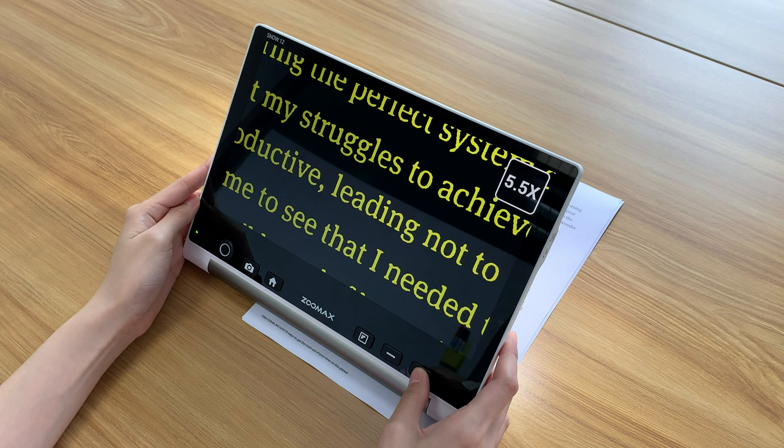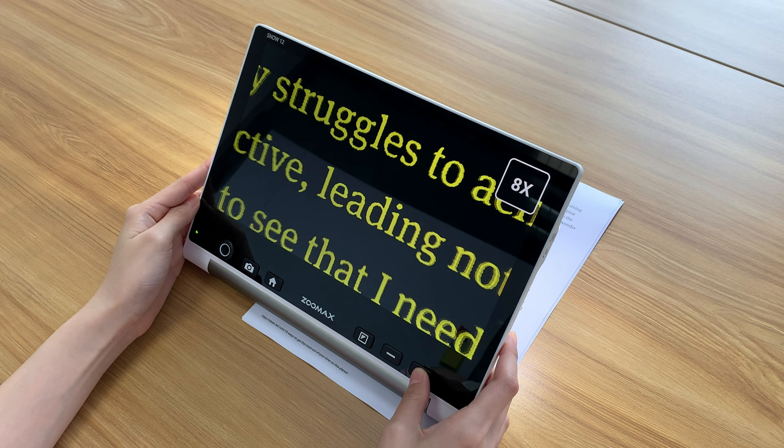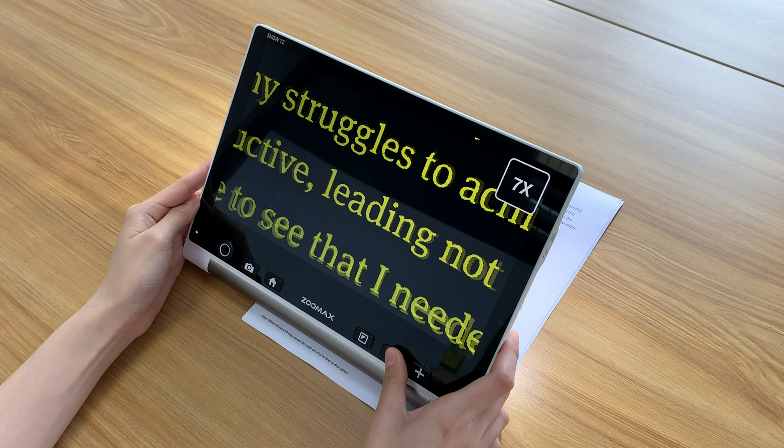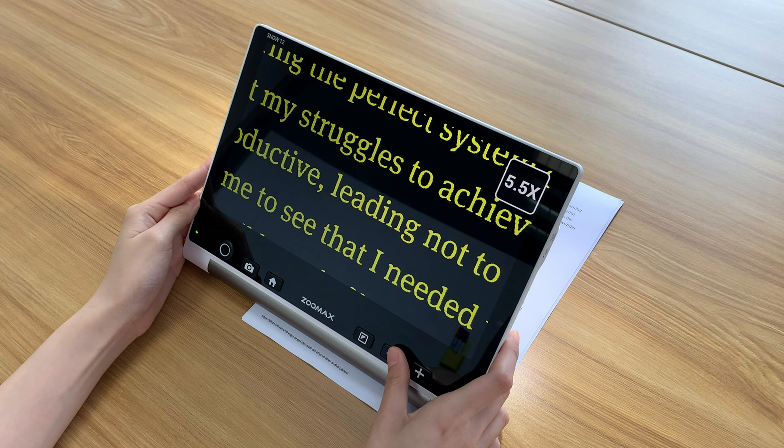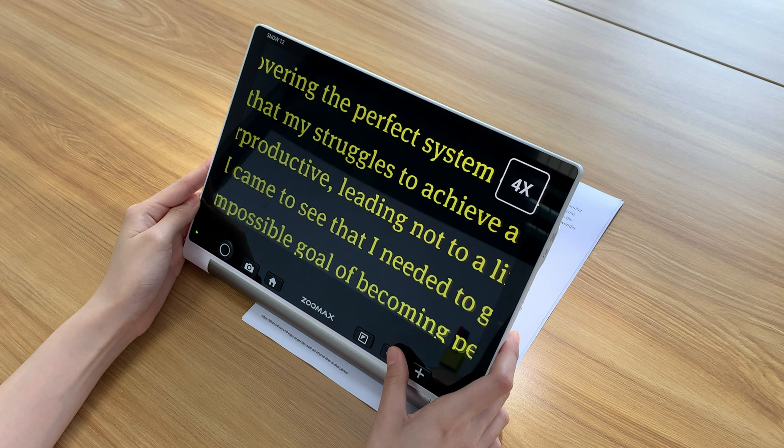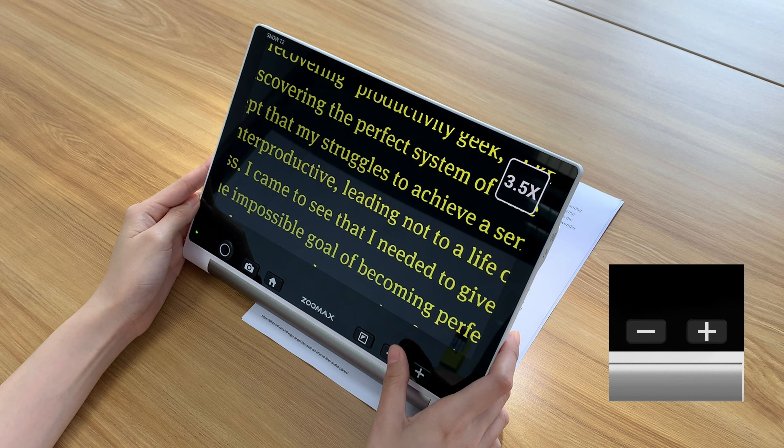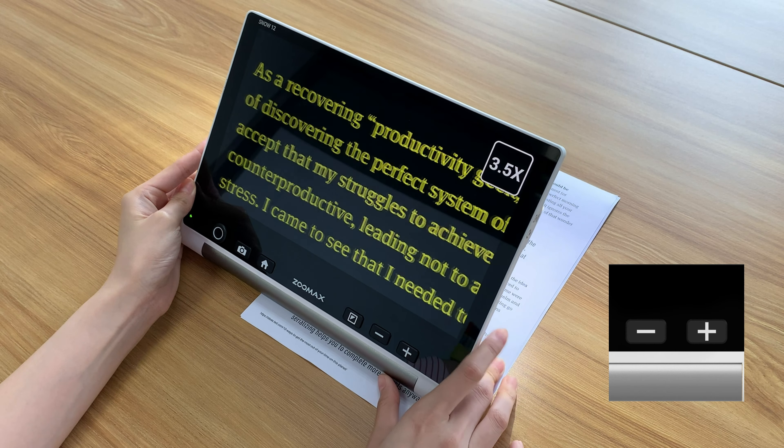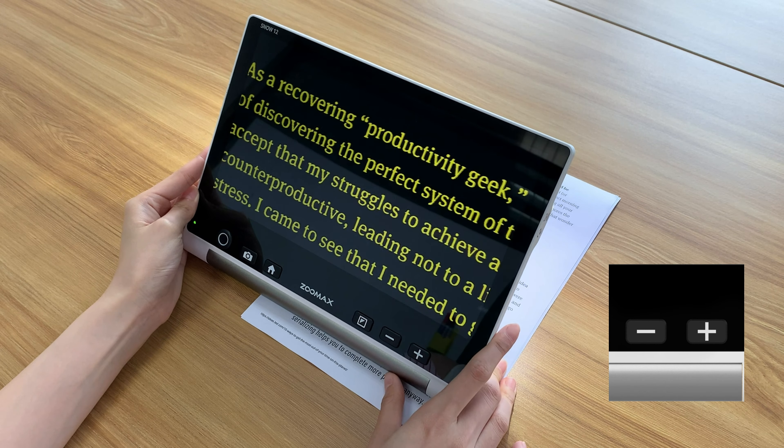Snow 12 offers magnifications from 2.7 times to 19 times. You can press zoom in or zoom out button to select a suitable magnification.